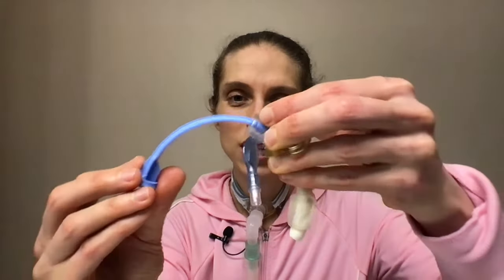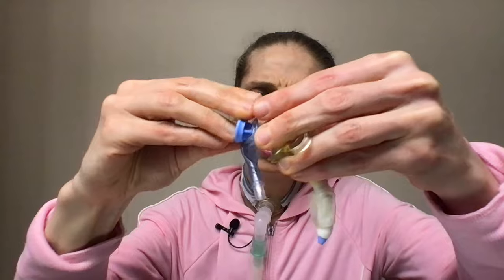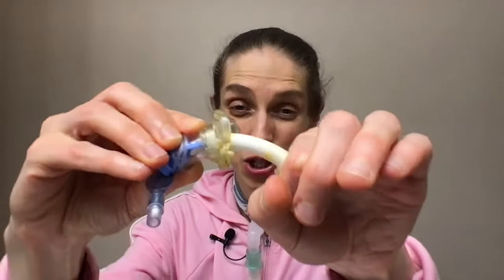Let me show you. Here is your tracheostomy tube. Let's insert the obturator. It's very simple. You just insert it. Once this is inserted, you can put some lubricant jelly on and insert it into your trachea. Let me demonstrate why this is so important. It has a rounded tip. Do you see that right there? Beautiful, wonderful. It can easily slip into your tracheostomy hole and be inserted.